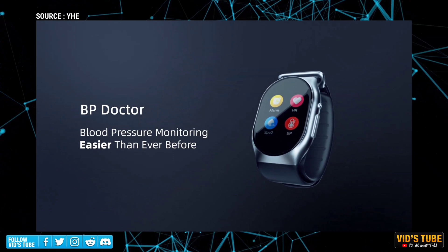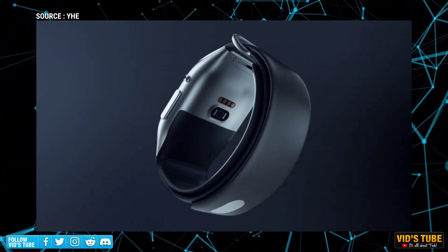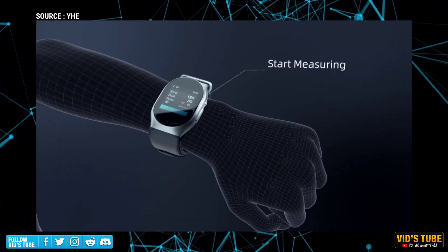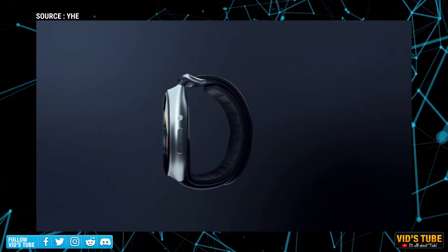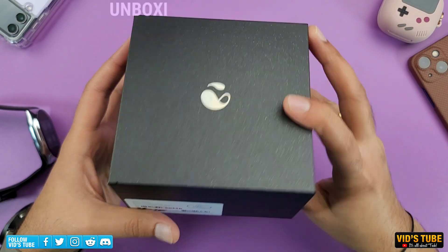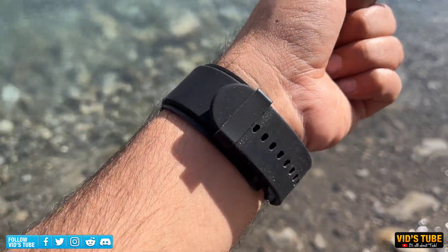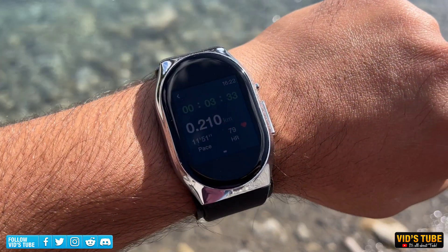Finally, a brand named YHE Technology reached out to me to try out their BP Doctor Pro smartwatch, which actually has an inflatable wrist cuff — far better and, more importantly, more comfortable than those bulky arm cuffs. Plus, it has many smart features. Let's start by briefly talking about price, unboxing, and smart features, after which I'll test the accuracy of all the sensors against medical grade monitors and wrap up with my final thoughts and room for improvements.